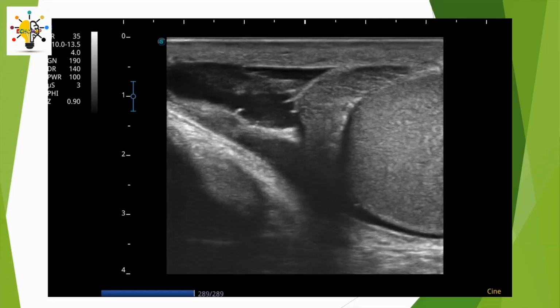So when we go straight to the pathological side, this is the first image we get. We have a sagittal section with our right testicle here. Here we have the epididymis, the head of the epididymis, which is still pretty large. It's quite big. We'll see later. And then some fluid here, perhaps with the appearance of septa, at least inside this fluid, inside this hydrocele. So these are our three structures to watch out for. And then here, we have the scrotal skin, through which we will perform our ultrasound.